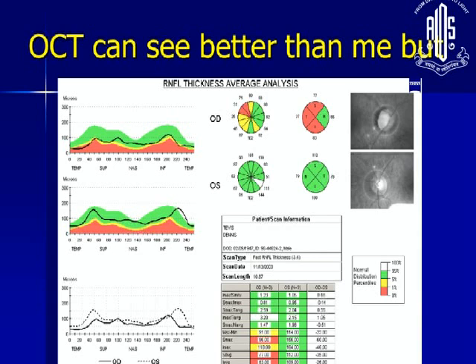Please remember that OCT can be a good test for you to see whether the nerve fiber layer is thin or not. There have been studies which have shown that if the patient has long-standing no perception of light, he would still have an optic nerve thickness of around 45 or so. So in other words, if there is a long-standing no PL, you would expect very thin or no nerve fibers, but when you measure it through OCT, you'll get a number of 40, 44, 45. And that you get because of the presence of glial tissue.